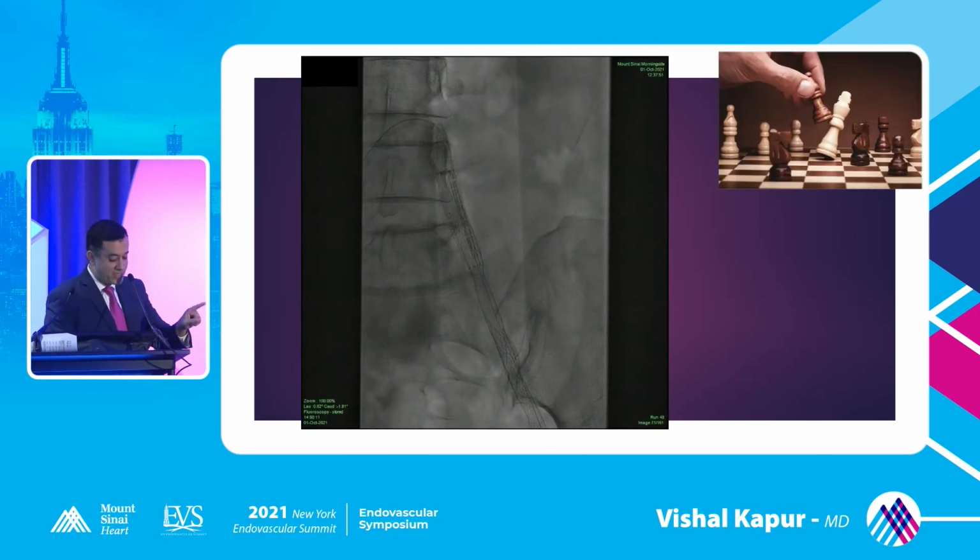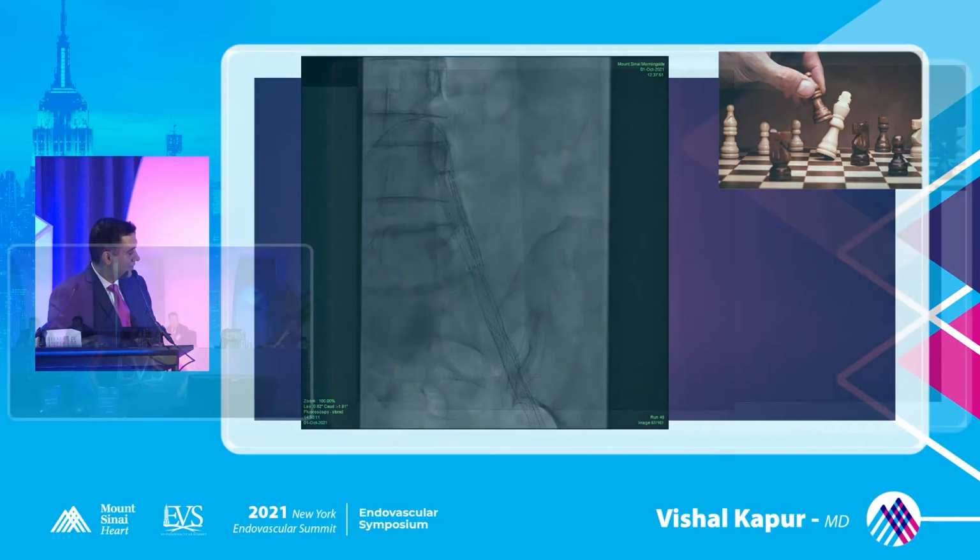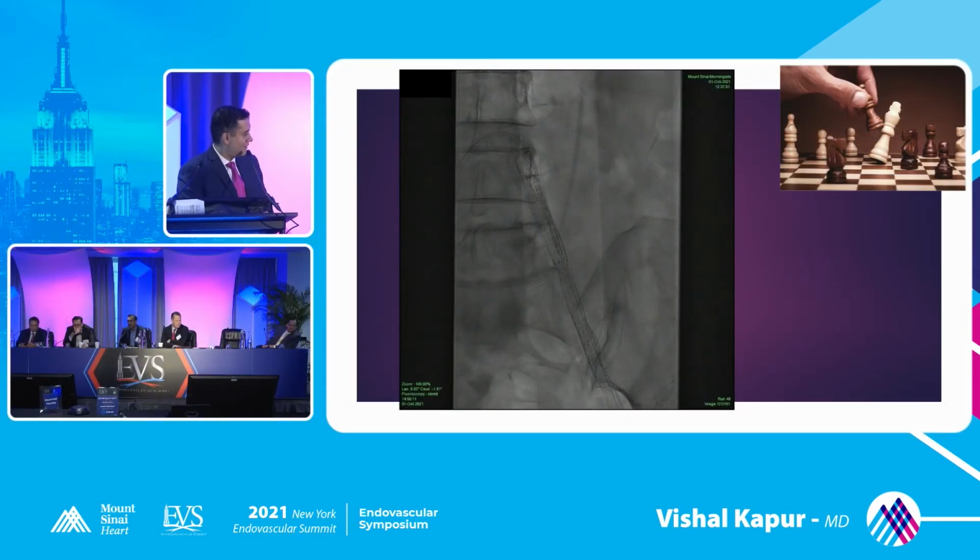Okay. So look at the picture closely. So I get a covered stent in there, but can you see, it is pre-deployment? Can you see what the problem with the covered stent is? You got to go to lateral.